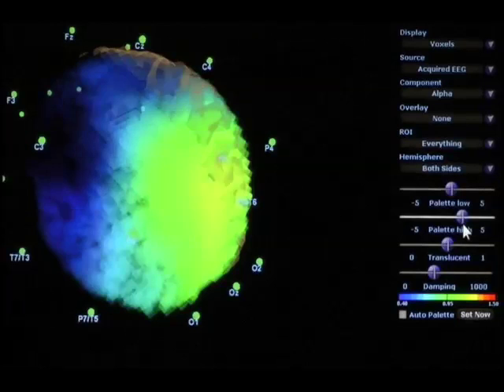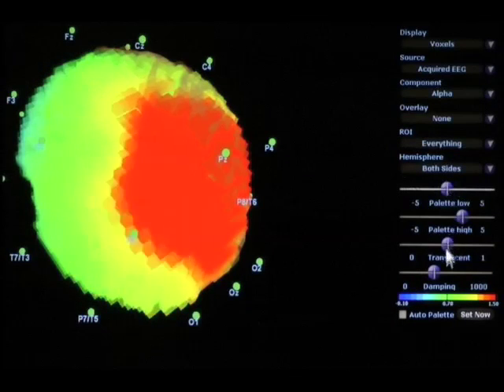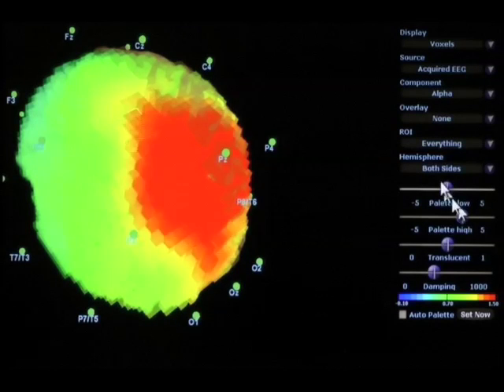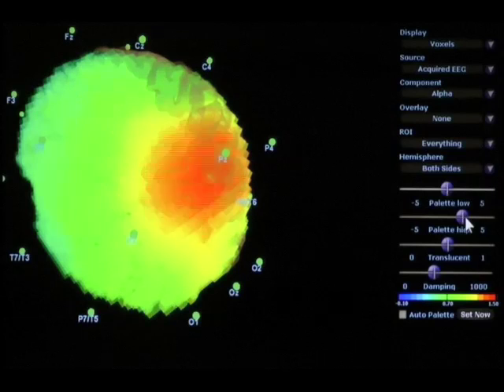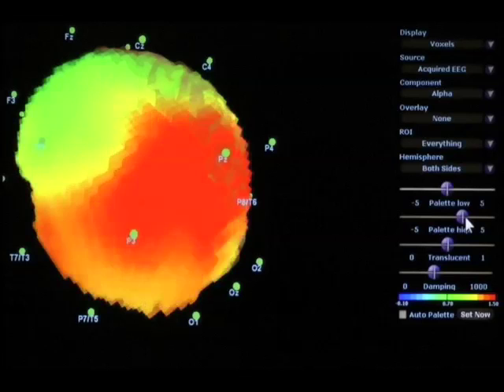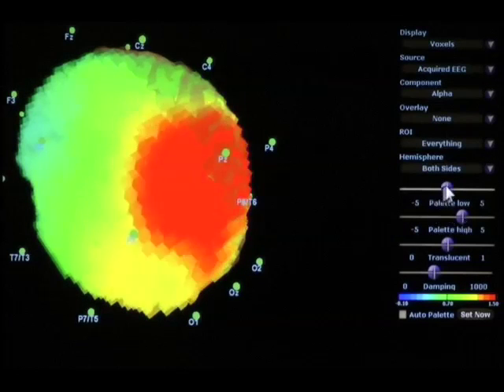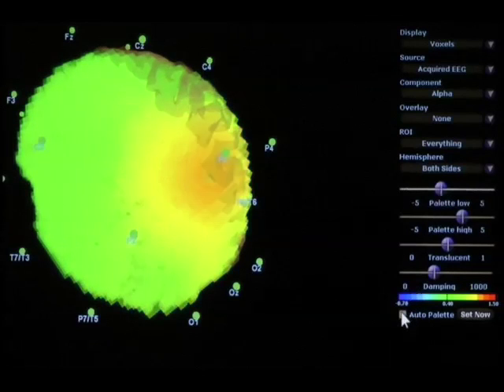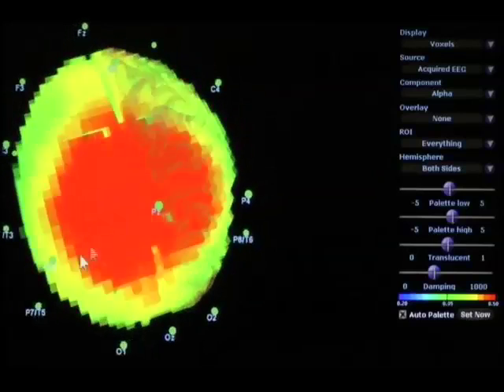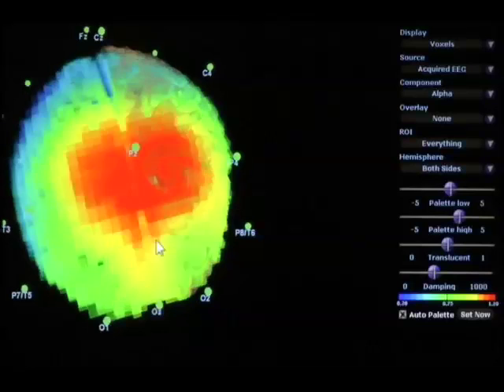I generally recommend using auto palette for viewing records and you can still look at these indicators and see where the readings typically are. When you use Z scores, you'll find it's easier to use manual setting and you can set the palette at one or two standard deviations. But if we go back to auto palette, it will automatically set those values so that we're getting an optimal display of what's exactly going on at that time.